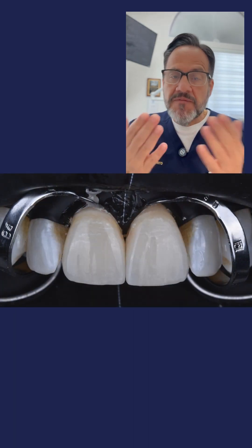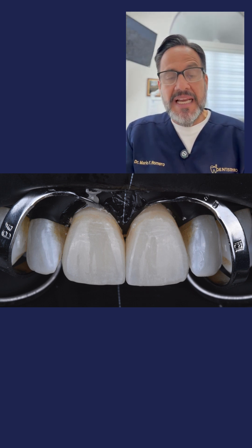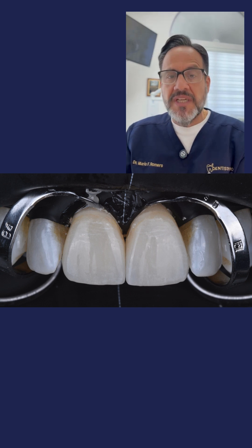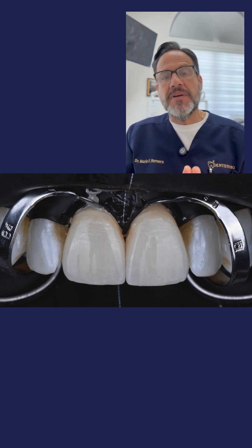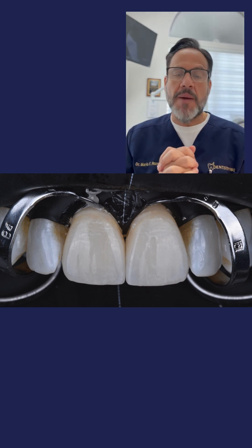Let's go to photo number two. In photo number two, you are seeing my delivered ceramic restorations. These were bonded to the tooth structure, and we know that in order to bond perfectly well, you don't want any contamination of your operative field. So the answer to the question is yes — there is no better way to isolate than using a rubber dam. See you on the next reel.